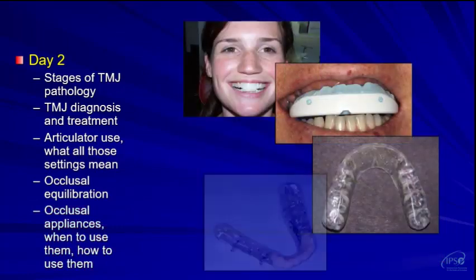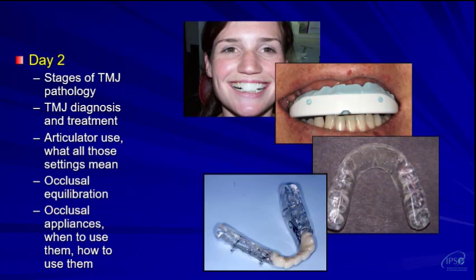There are many types of occlusal appliances, all the way from the custom fabricated occlusal deprogrammers, the prefabricated deprogrammers, to the full arch occlusal appliances. Even airway management appliances are also occlusal appliances, and we'll discuss why.